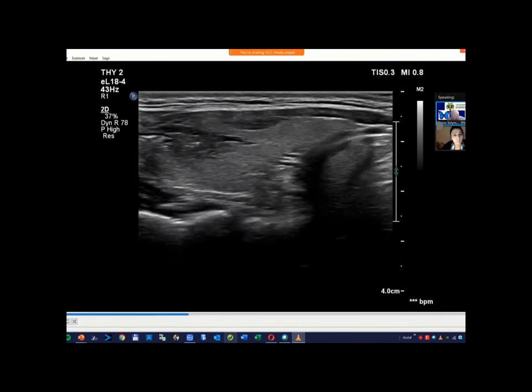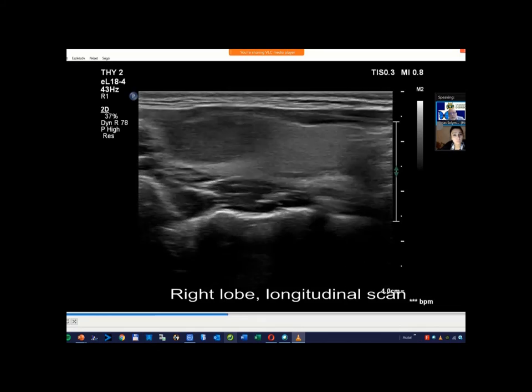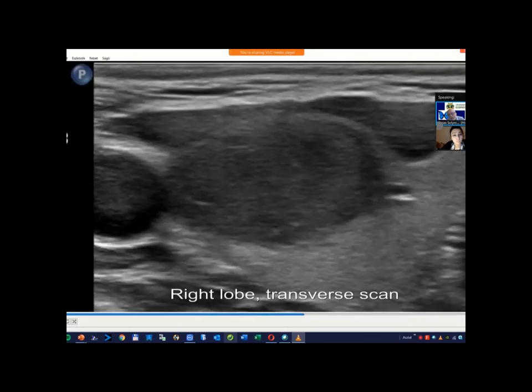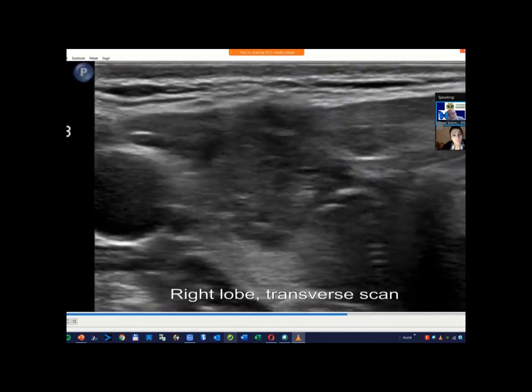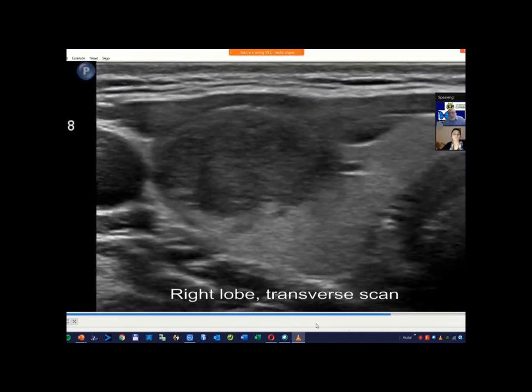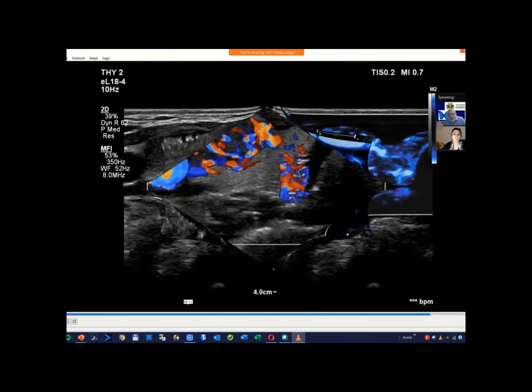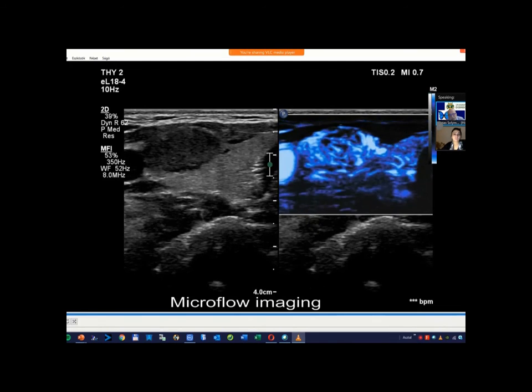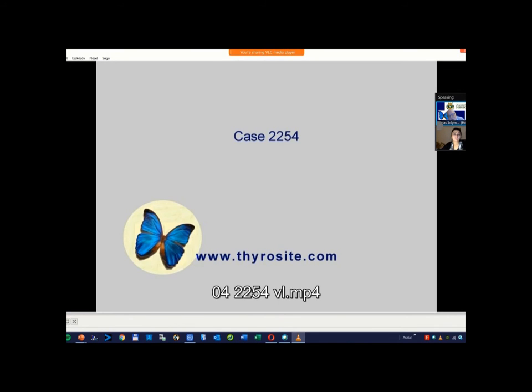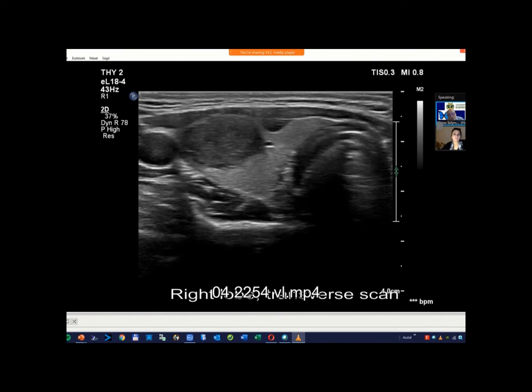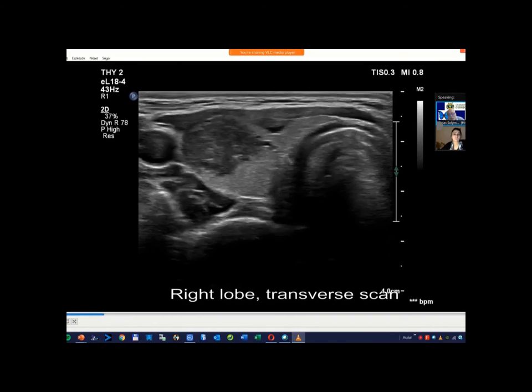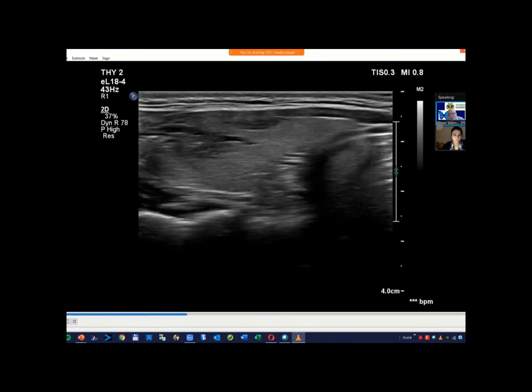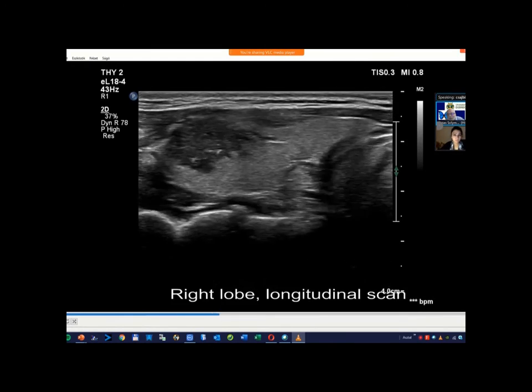Indeed, this nodule proved to be a T1 papillary cancer without any extrathyroidal extension on histopathological analysis. This case illustrates the weakness of this sign, and this is the reason why, for example, the European guidelines do not include extrathyroidal extension among suspicious characteristics.